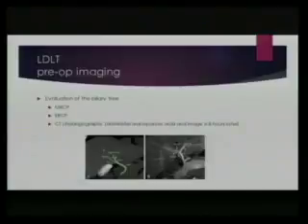Okay, so then we need to evaluate the biliary tree. MRCP is a good way to do that. Sometimes they will do more than one of these routes just to make sure they have everything delineated perfectly. So occasionally they'll do ERCP as well. Some institutions do CT cholangiography where they administer oral iopanoic acid. I've never been involved in a case of this.